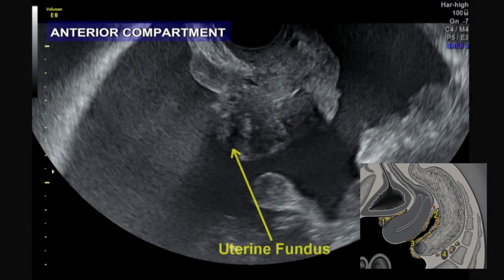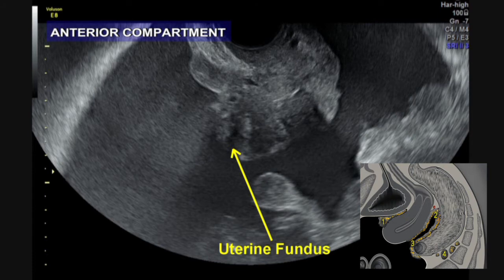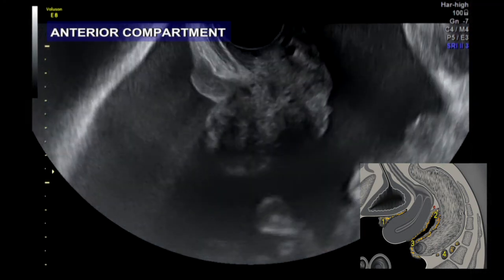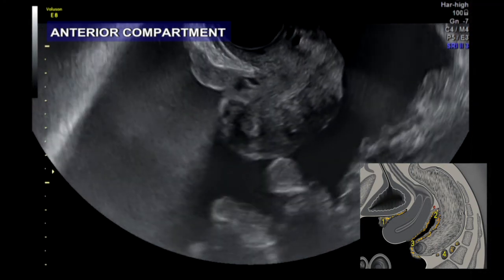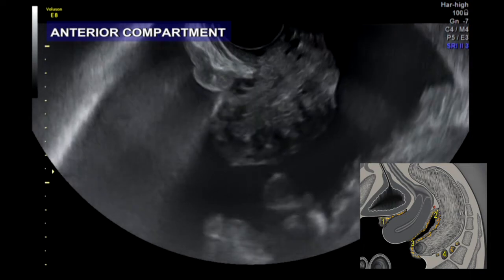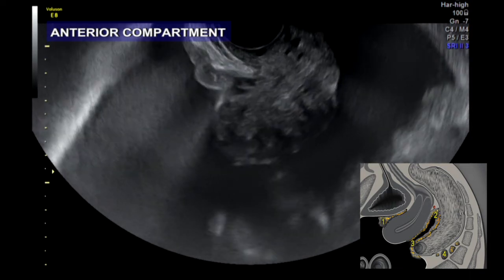You can see the uterus. First we will take a look at the anterior compartment where the carcinomatosis is located in the vesico-uterine pouch. In this patient the carcinomatosis is characterized as a diffuse, thick, hypoechogenic layer, not infiltrating the bladder.